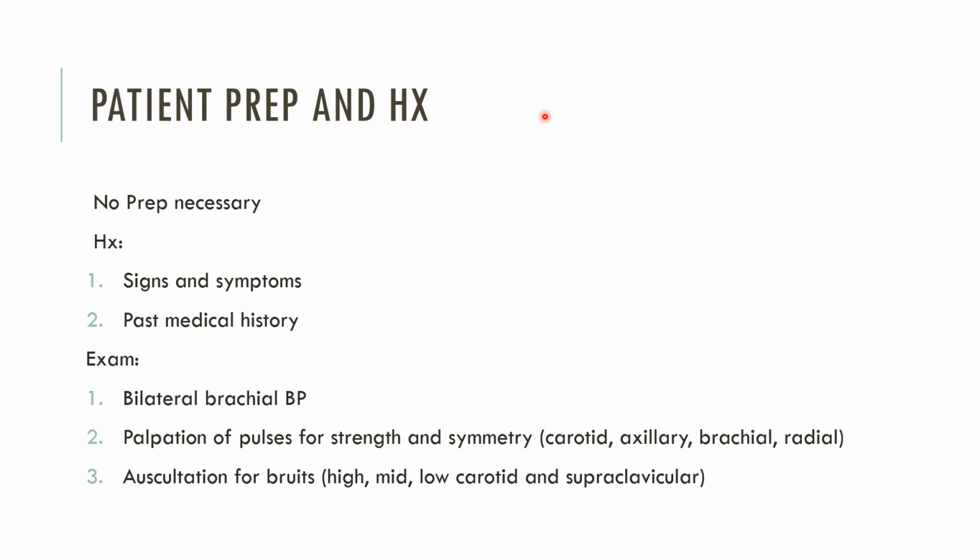that could indicate that disruptions or stenosis in the brachiocephalic or subclavian arteries could actually be affecting the blood flow to the carotid. So it's important to get those to kind of rule out that we have a brachiocephalic or subclavian issue.